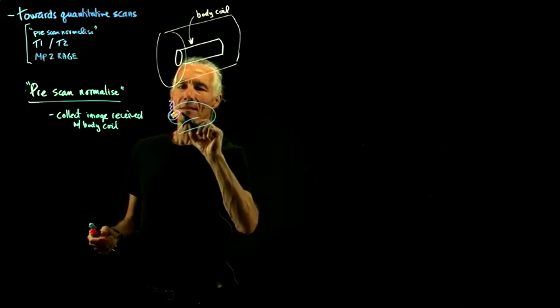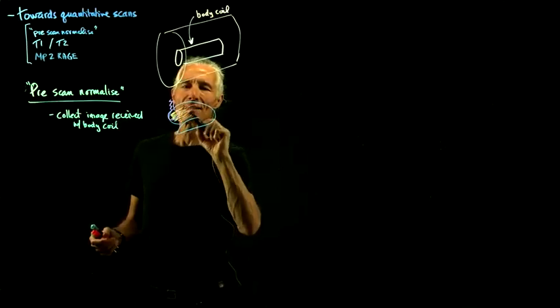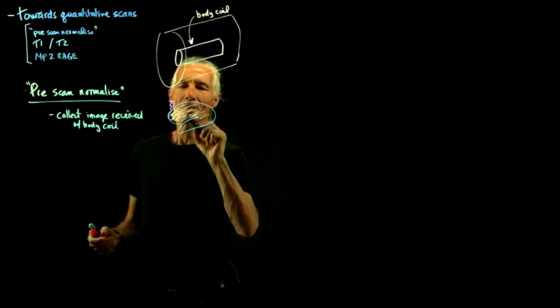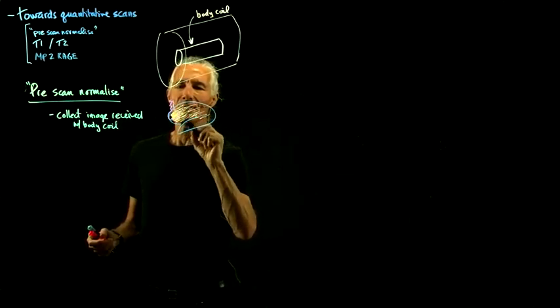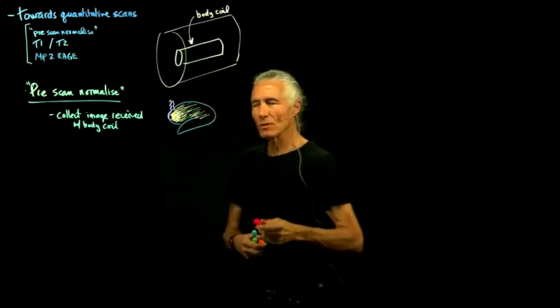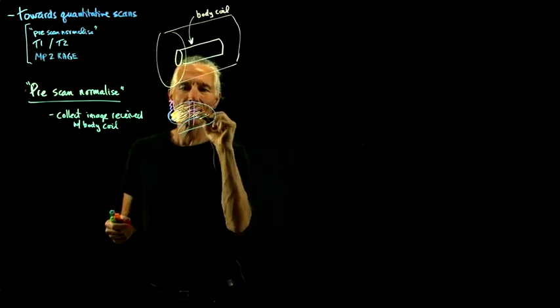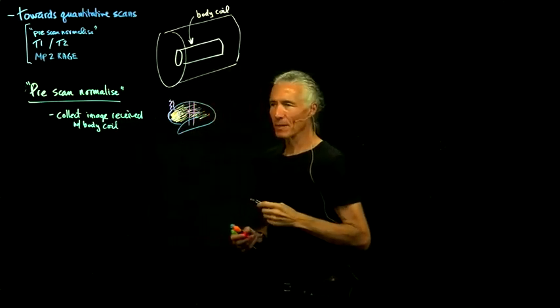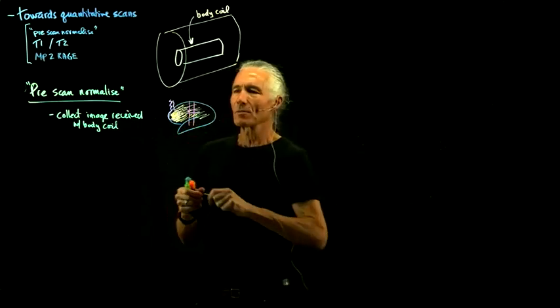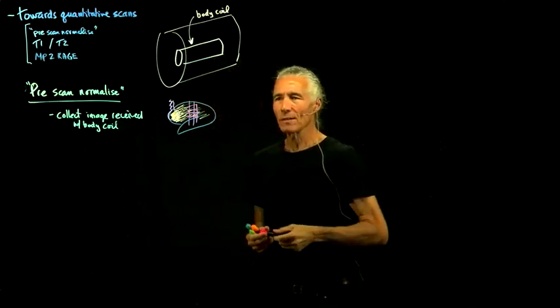It might be 200% brighter than the rest of the brain, but it's going to fall off nice and slow. So when you look at this brightness field, it's nice and smooth. And because it's smooth, you don't have to collect very small voxels. Any old voxels, about that big, are big enough to give you enough information to calculate that relatively smooth field.